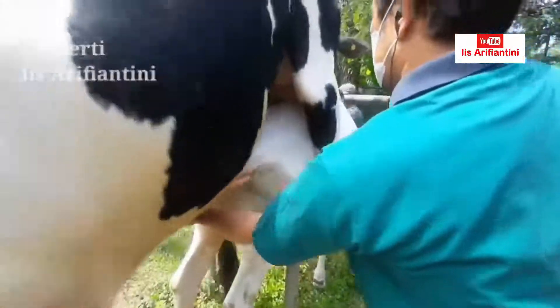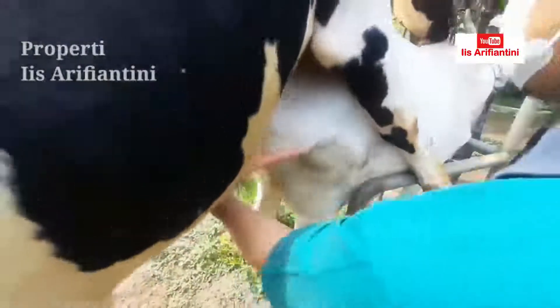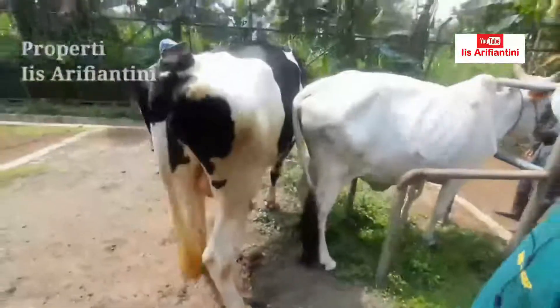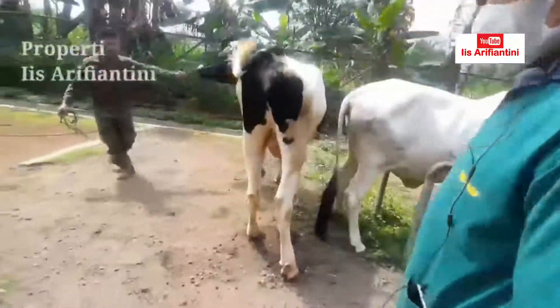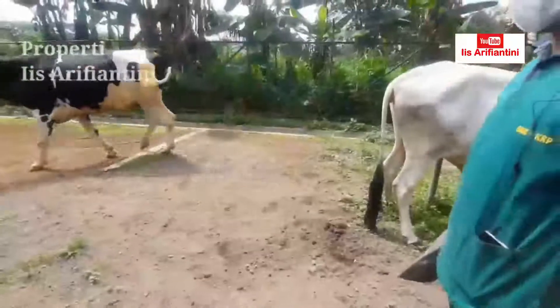Kita lihat ini ada cairan — ini adalah cairan preputium. Itu adalah cairan yang keluar ketika ada rangsangan awal sebelum ejakulasi.